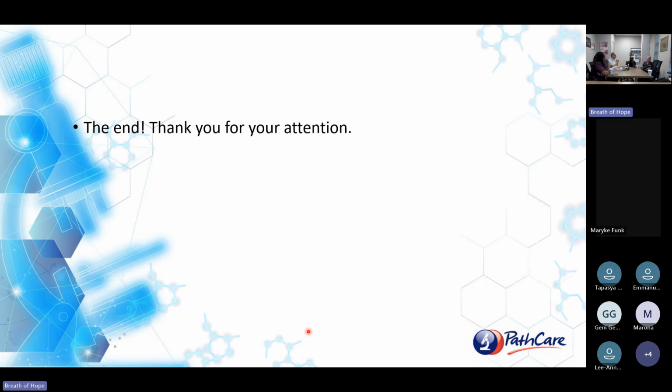So I hope that answers your question. It is a guide where clinicians use it for different reasons. For example, it's the only way to diagnose hyperfibrinolysis. But the best evidence for the usage of it is in guidance of blood product usage. It has not been validated as a diagnostic tool per se, although it can give you supporting evidence. So I'm not going to say don't use it. It's there. You can do it, whatever can benefit the patient, use it.